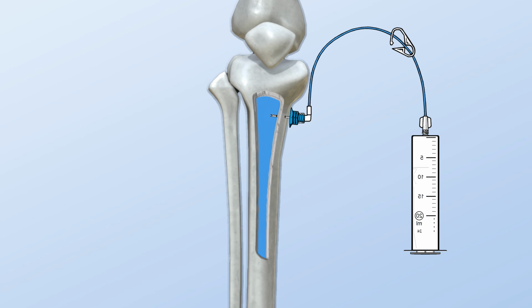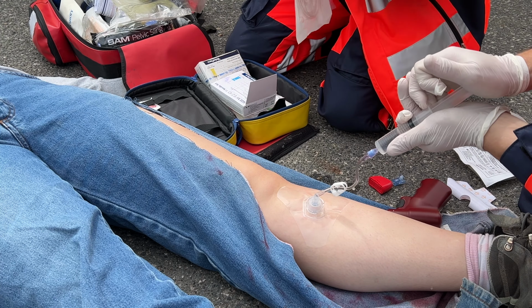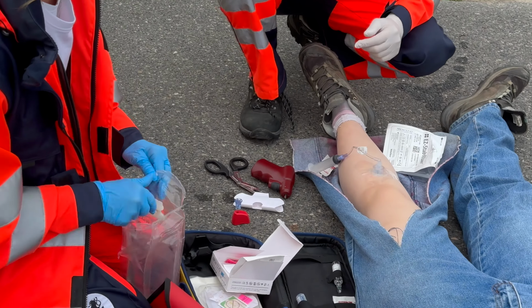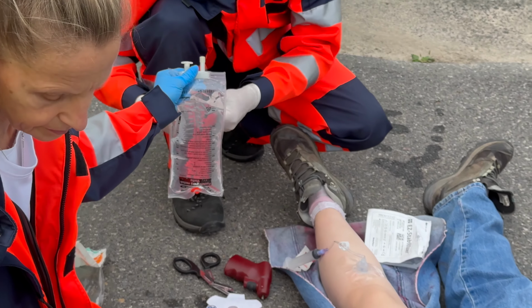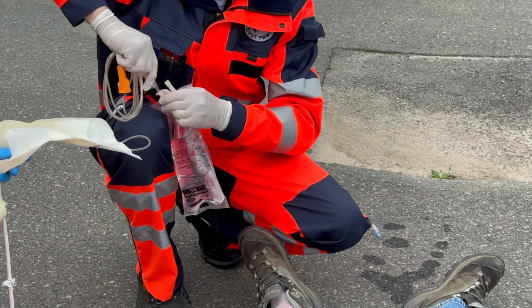Therefore, in conscious patients, it is advisable to first slowly instill a local anesthetic, for example, 5 to 10 milliliters of 1% mesocaine. Alternatively, in consultation with a physician, consider another suitable analgesic, for example, ketamine intranasally. Only then should the flushing and subsequent medication administration be carried out.